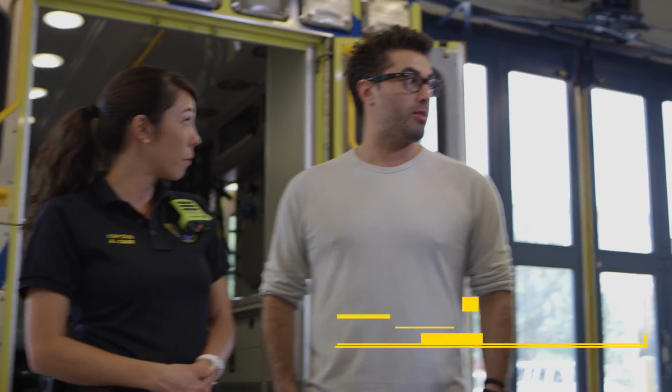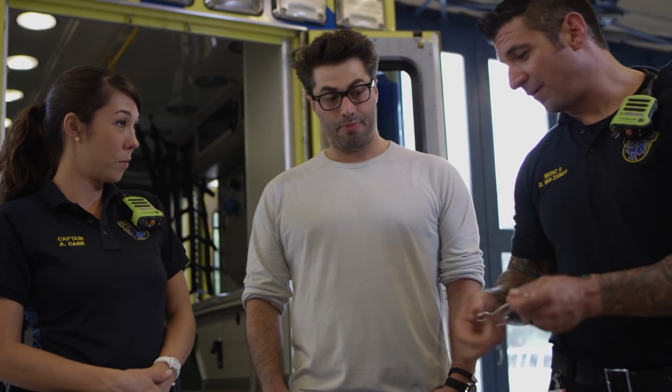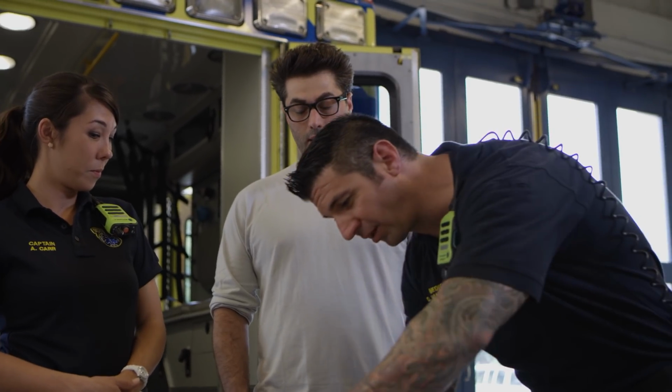Timing is crucial, right? So if you do sense, all right, they're choking, how much time do you have to pick the right tools? How much time can you hold your breath? So that's what it is. If you have an obstruction in your airway, we visualize it first with this thing here.